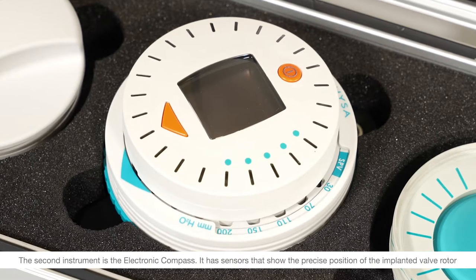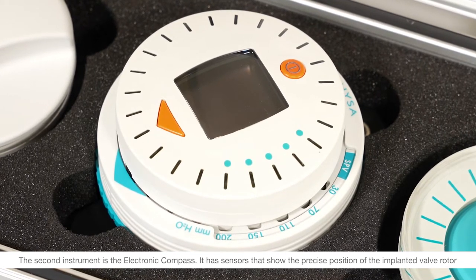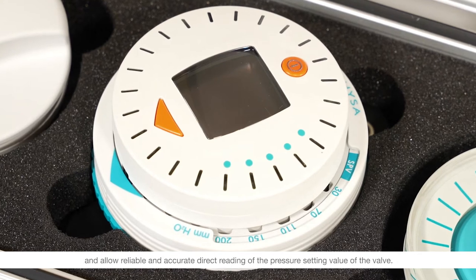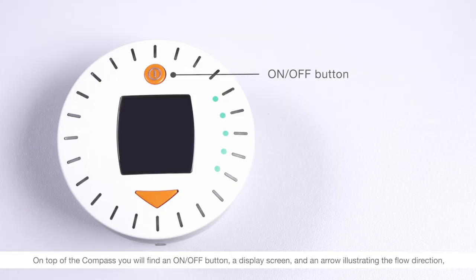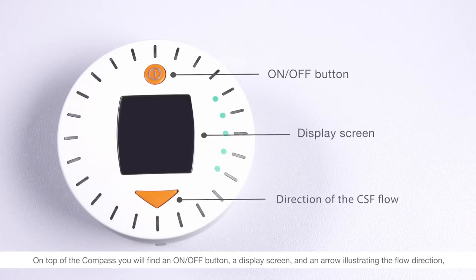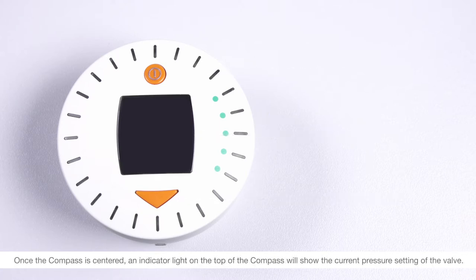The second instrument is the electronic compass. It has sensors that show the precise position of the implanted valve rotor and allow reliable and accurate direct reading of the pressure setting value of the valve. On top of the compass you will find an on/off button, a display screen, and an arrow illustrating the flow direction to confirm that the compass is correctly inserted into the locator. Once the compass is centered, an indicator light on the top of the compass will show the current pressure setting of the valve.